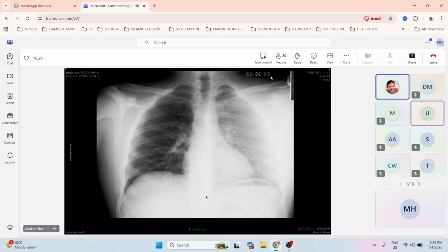Nowadays, that skill is gone, because the moment you see something, you will straight away do a CT and it gives you the answer. So things have changed nowadays. But the silhouette sign, if in the exam you're given a plain radiograph, would be very useful.